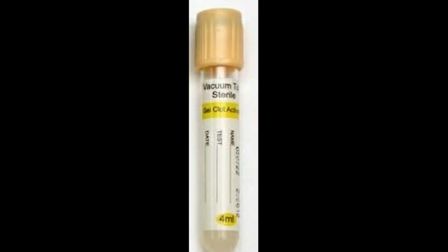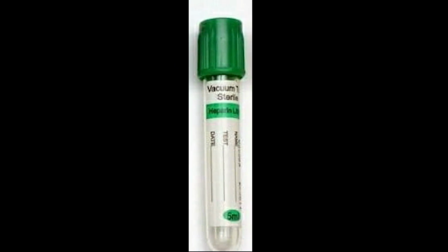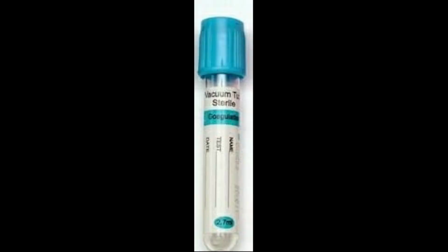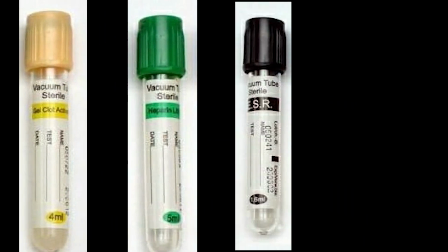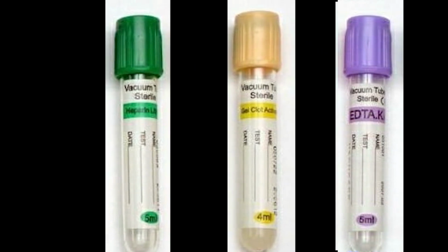For example, chemistry sample collected after potassium EDTA. The increased level of potassium available in the lavender tube can contaminate the chemistry tube and elevate the potassium level. In the same way, the heparinized test tube can contaminate coagulation studies, that is PT, PTT, INR results, if the citrated tube is collected after the heparinized tube. So, we need to make an order of draw to minimize these contaminations.